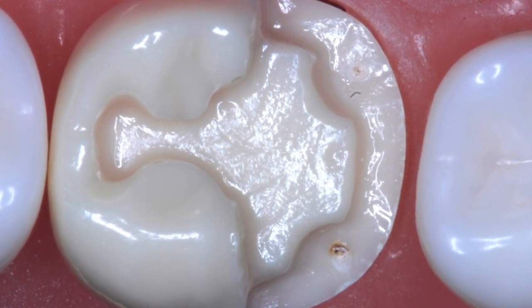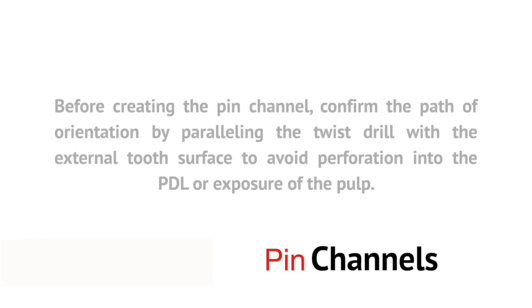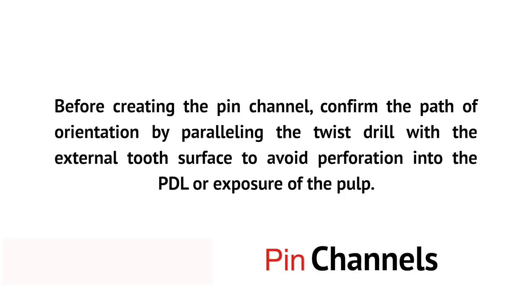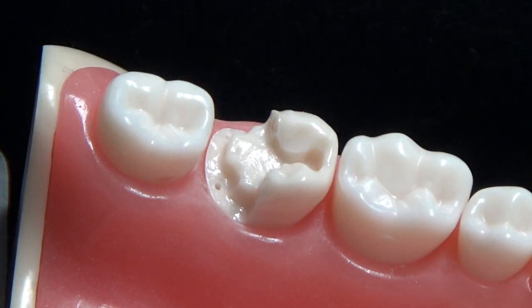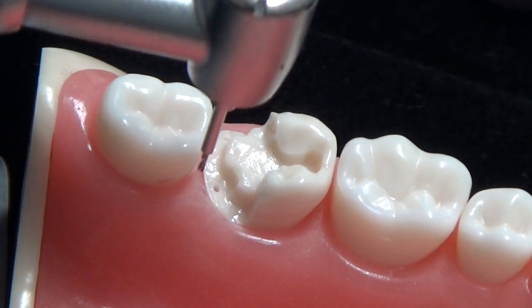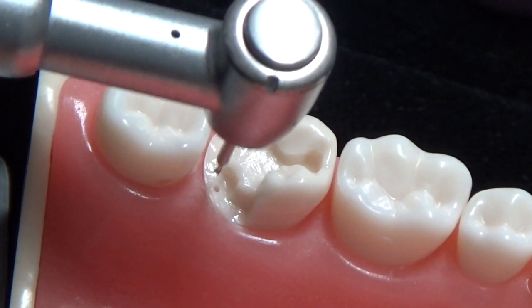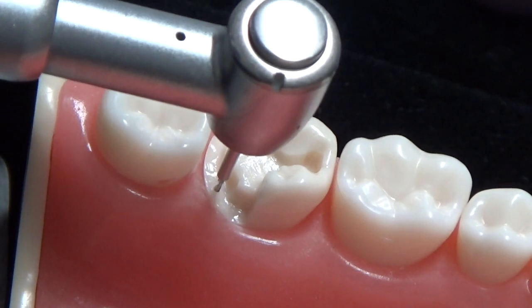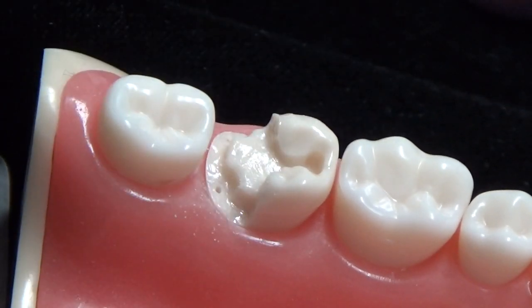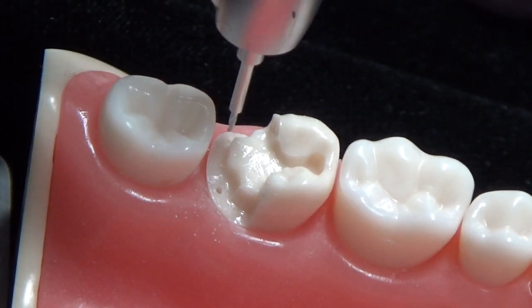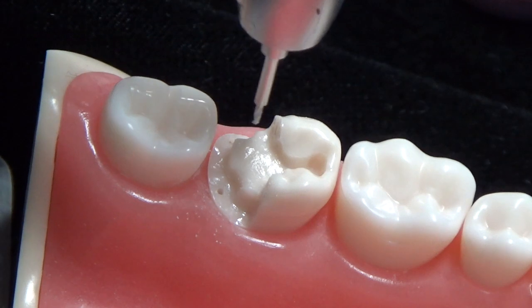The next step is to create our pin channels. I'm ready to make the pin channels, so I'm going to follow the path of draw so I don't damage the PDL or the pulp chamber. I'll go ahead and do the distal lingual — that's it, one time.